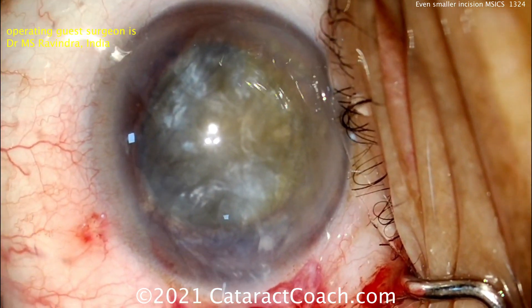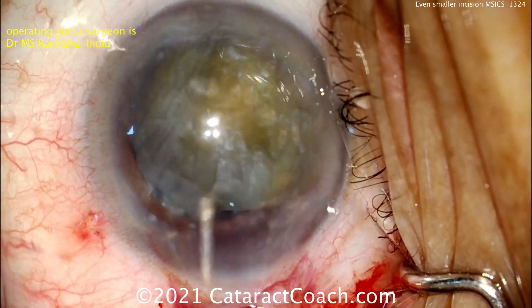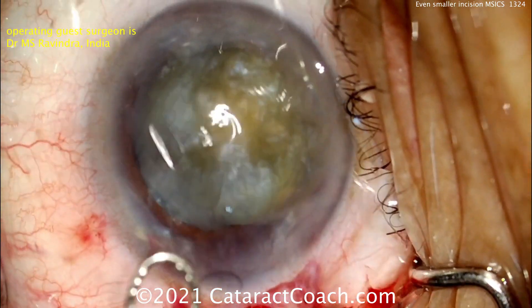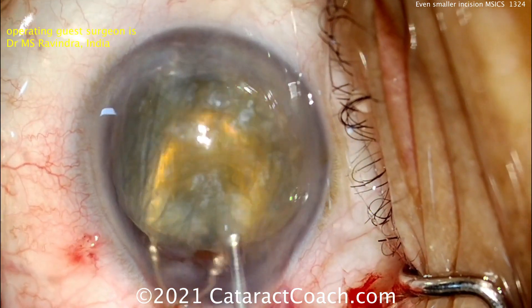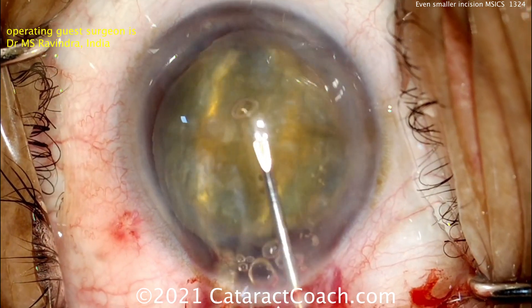That's a beautiful technique — not something I've ever done before, but I'm willing to learn. And now there's the nucleus. The lens loop goes under it. More viscoelastic in the other hand.